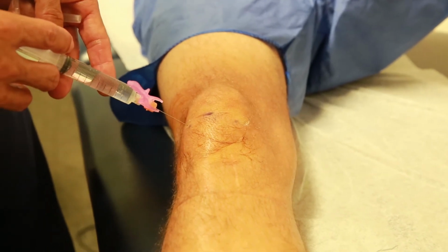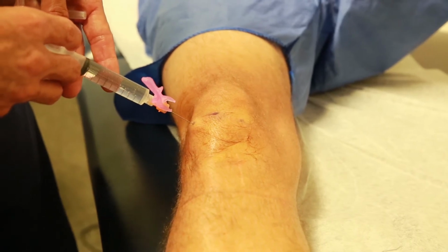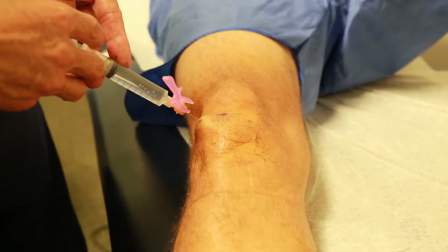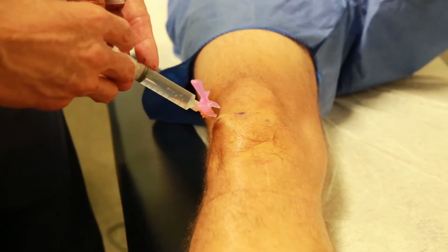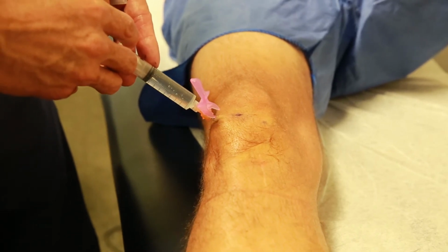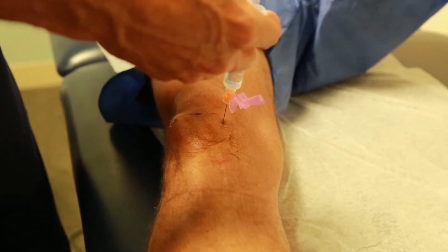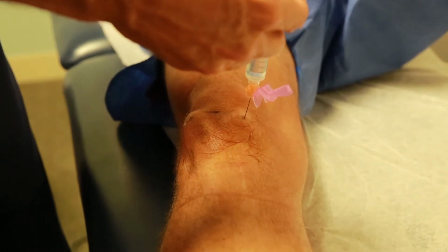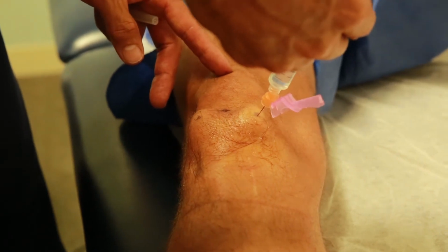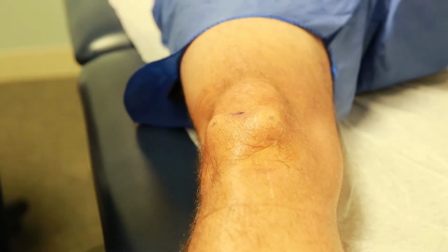Now a little bit of stick, Jason. So a little stick, and we just want to numb this up. Now make a nice wheel in the skin, and then we go down, and you're going to feel a little bit of discomfort as we get to the fat pad. Now, some doctors like to use this needle to sound in the joint so they can figure out where they are, and that's fine. I'll often go to this side as well, and it's that initial stick that hurts and burns. I'll put a little bit in the fat pad, but not a lot in the joint. If you put too much in the joint, then you're going to have difficulty seeing. And then we just relax.